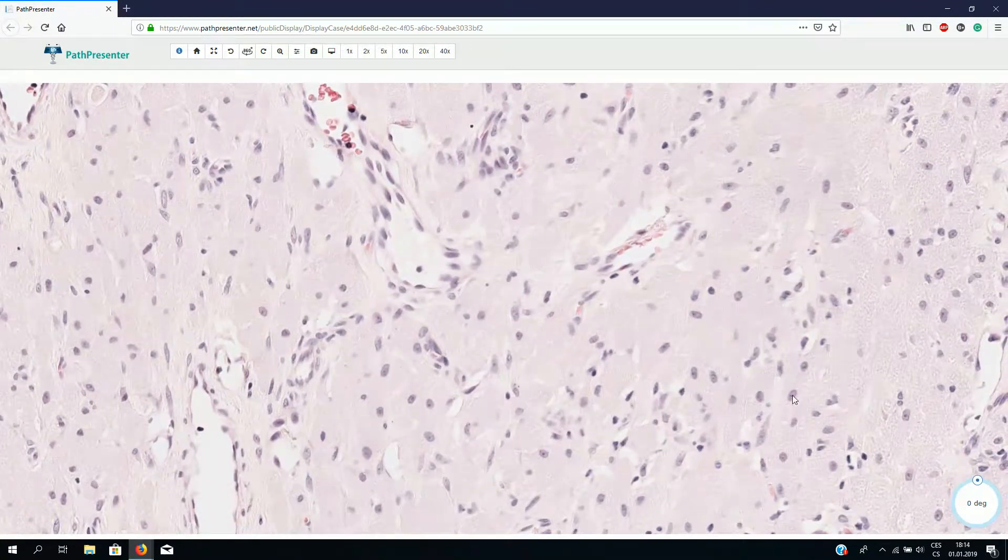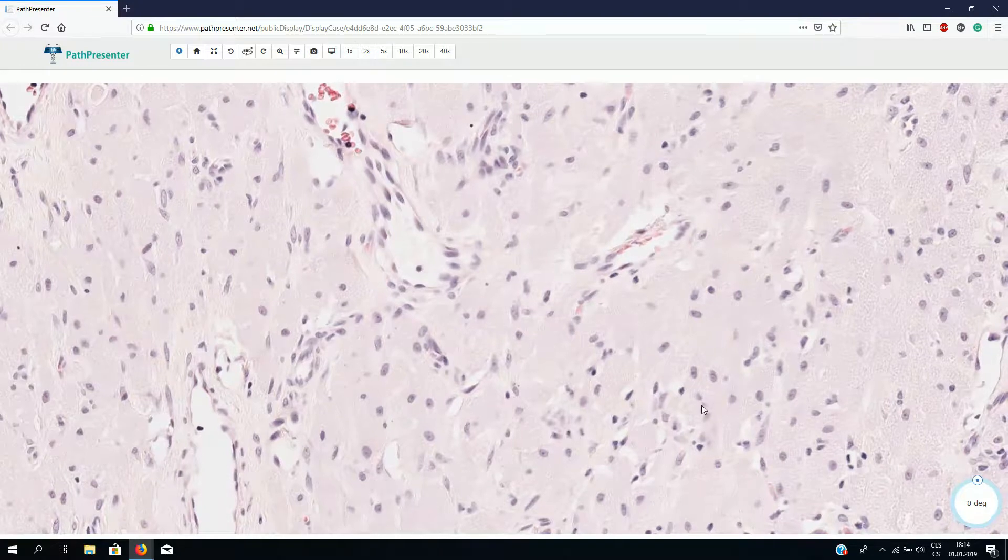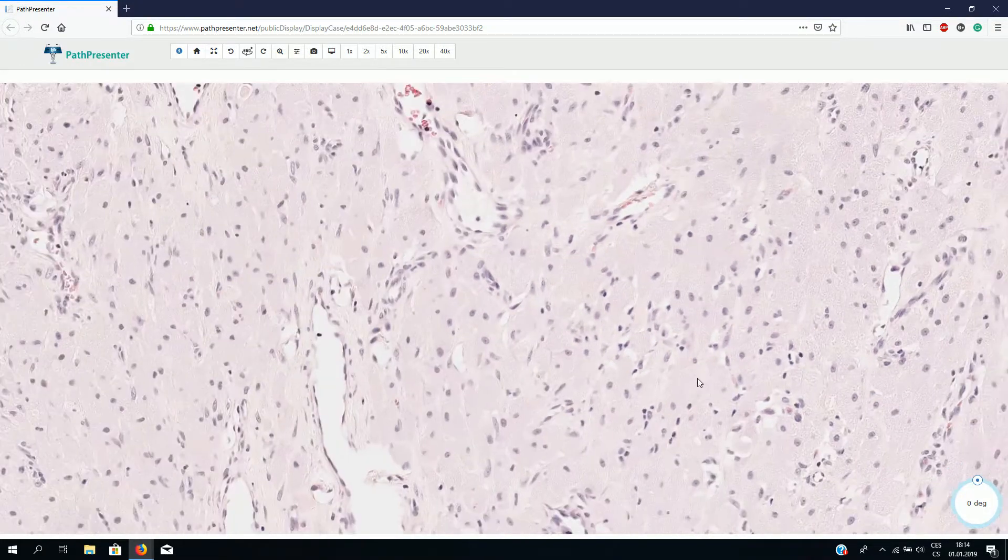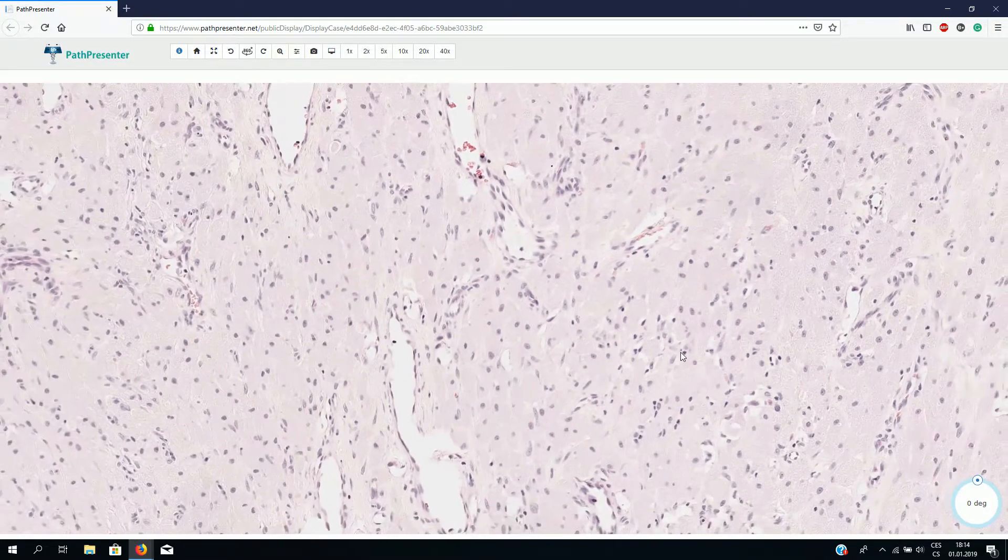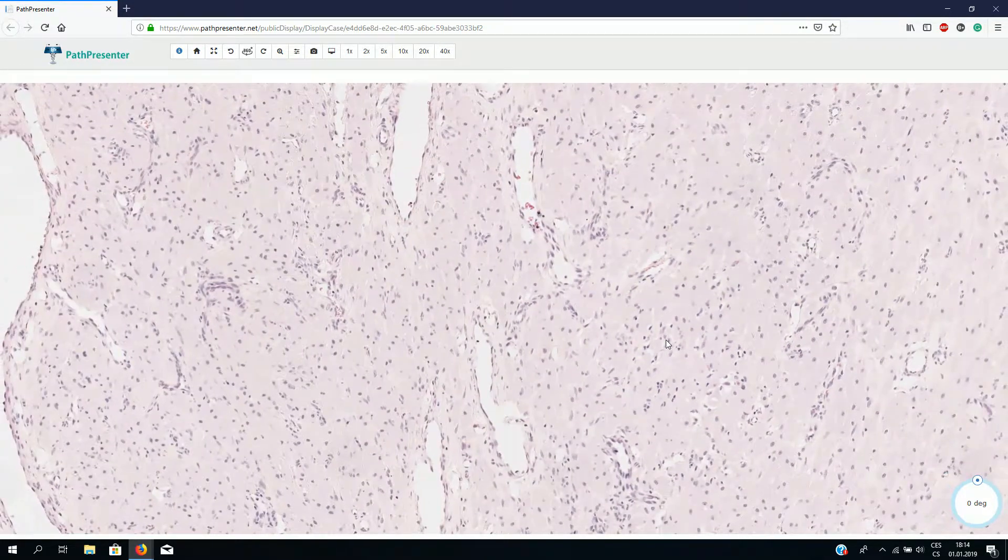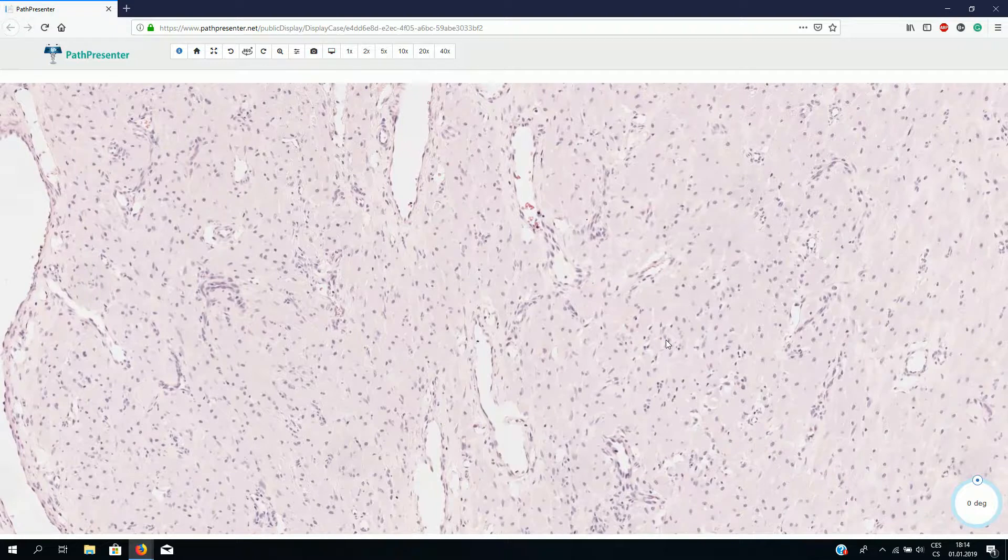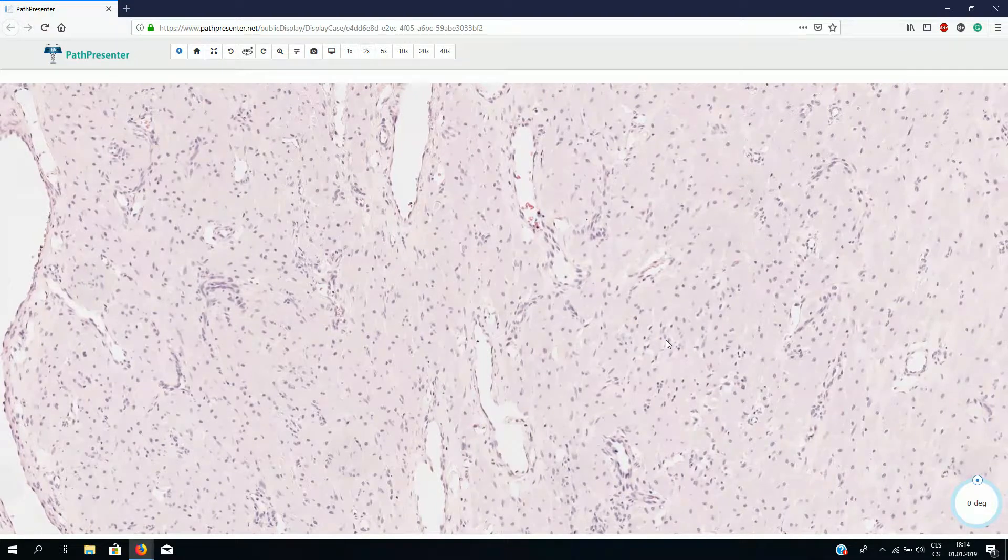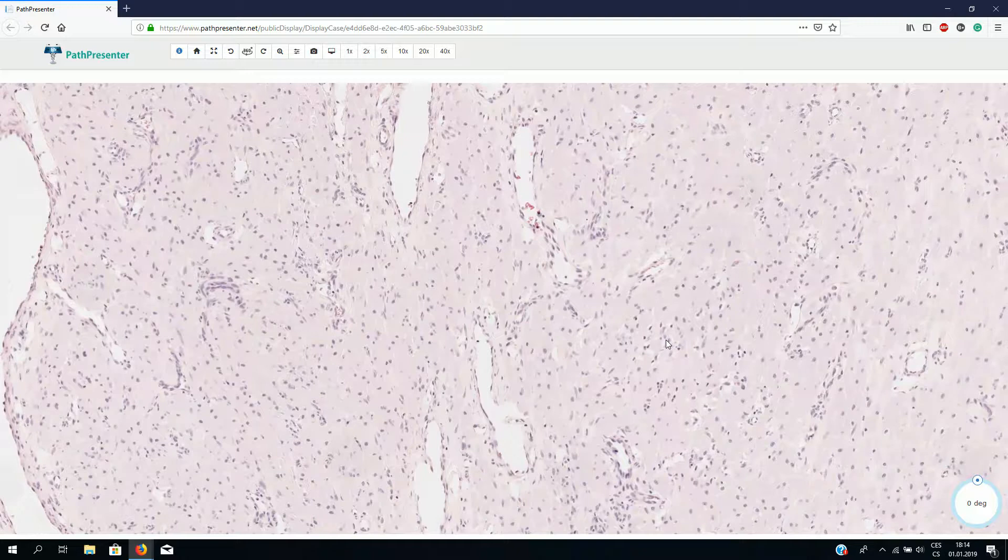We usually do not see any nuclear atypia or mitotic figures. These granular cells are immunohistochemically positive for CD68 and should be negative for S100 and SOX10.